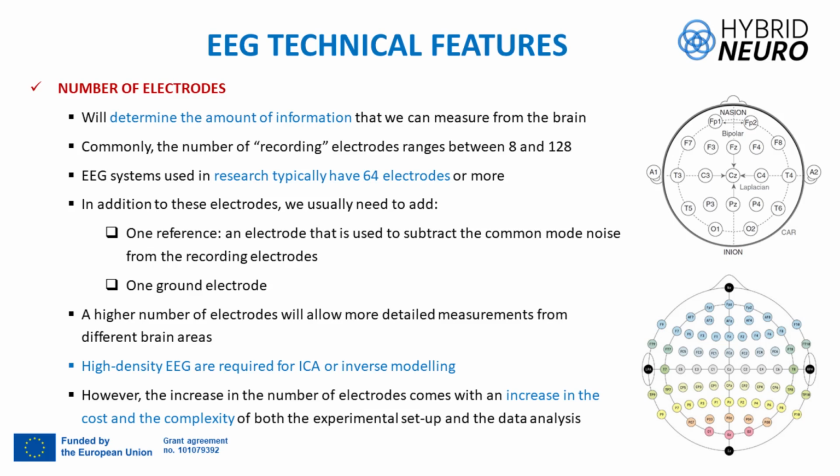We can see here in the middle the central channel, more frontal the frontal one, and then it goes back to the parietal. This is temporal. You know, this is the nose, the ears. It's looking at the head from the top, and also parietal, and on the back the occipital channels.